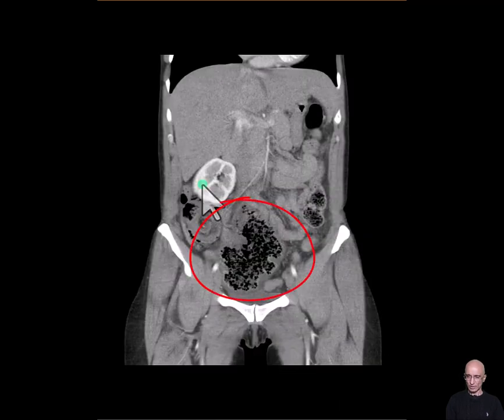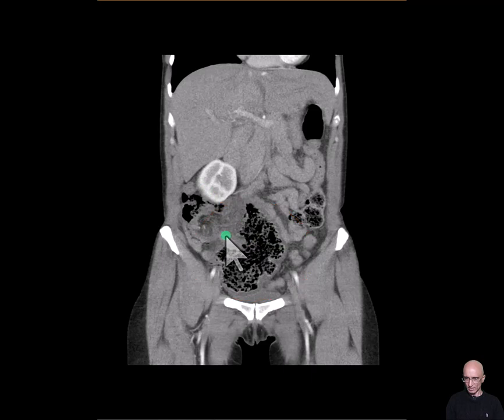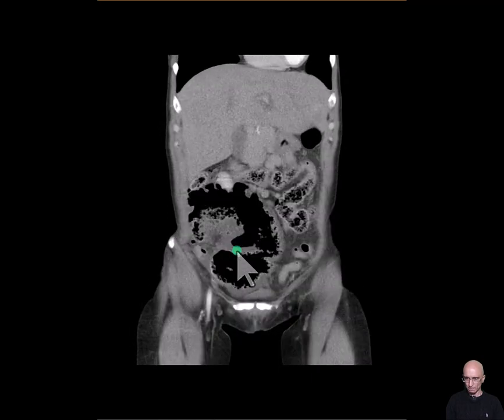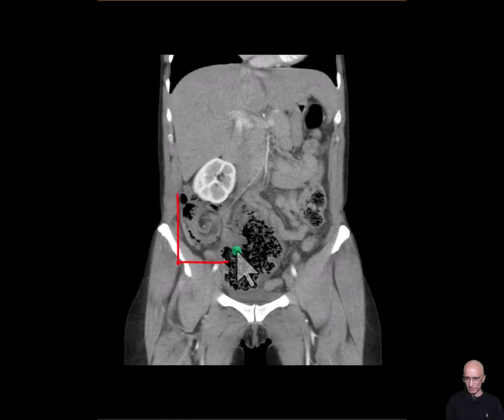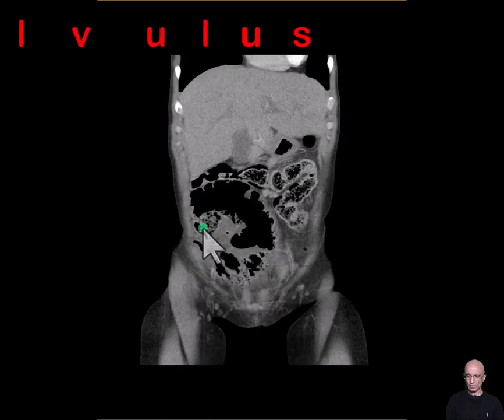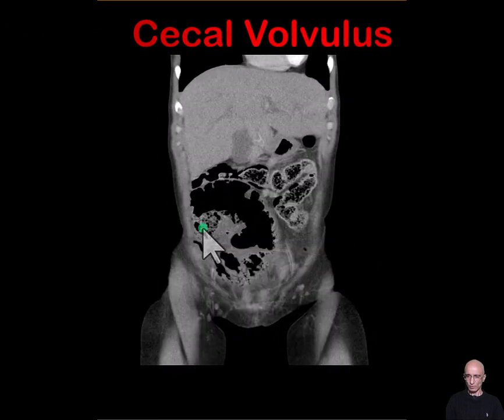Now let's look at the coronal images. This is the abnormally positioned cecum — you can clearly see the thickened wall. This is the terminal ileum entering into the cecum. As I scroll back and forth, you can see swirling of the mesentery. This constellation of findings is consistent with cecal volvulus.